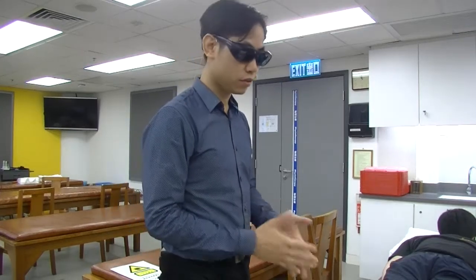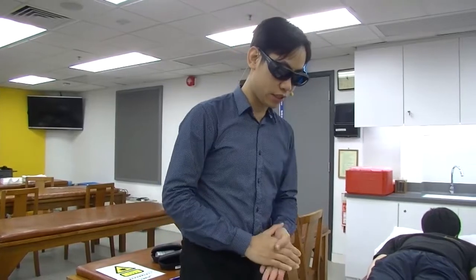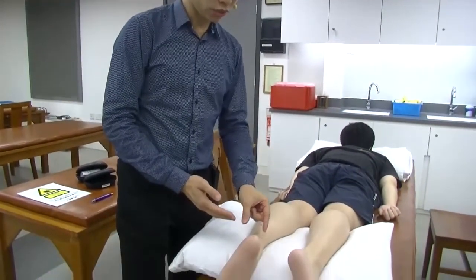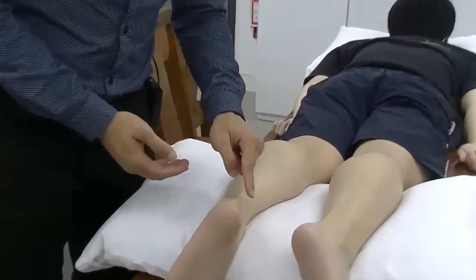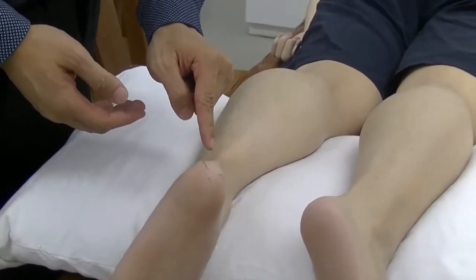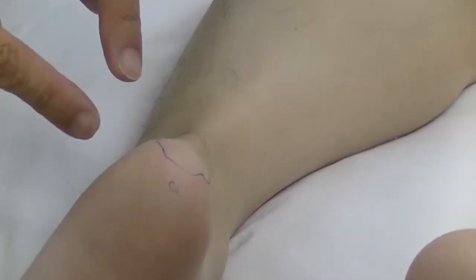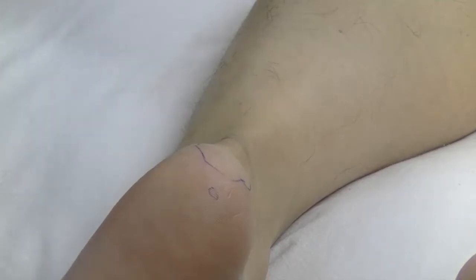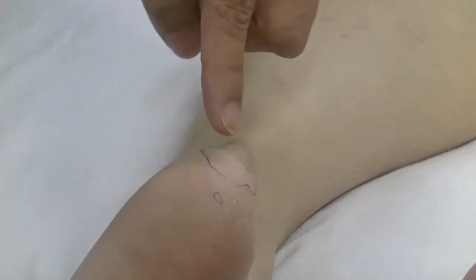Today we are presenting a case of a patient with diabetes. After checking the ankle, we found a wound at the heel region. The wound size is around 4 cm squared. The spots marked on the skin indicate where we should place the laser probe at the peripheral sites to facilitate faster healing of the wound. This is the wound bed.